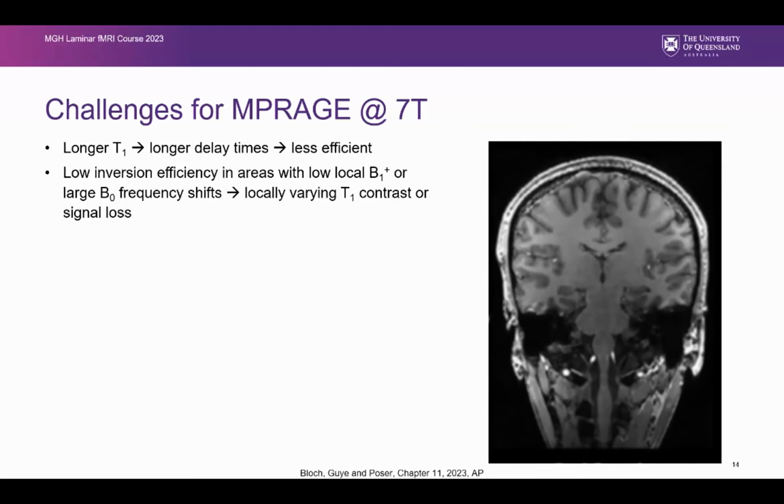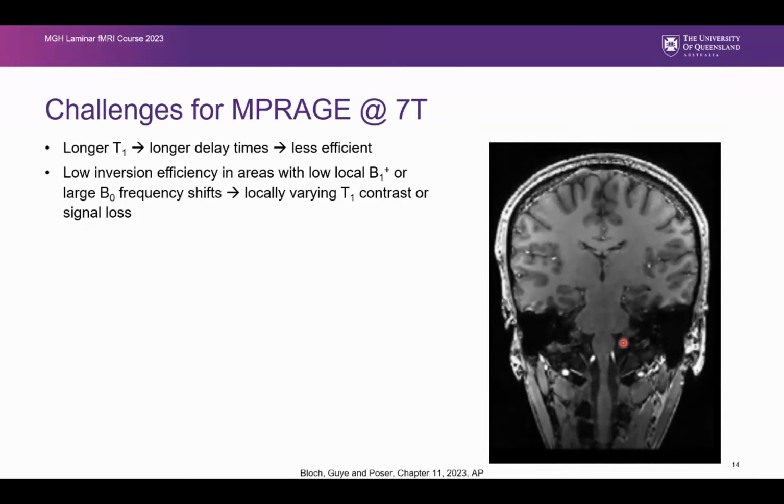And if we zoom in, we will look at this artifact again, but I also had a project with frontotemporal dementia, and the temporal lobes are very often, can you see that, it's just cut off? Is that coming through clearly?